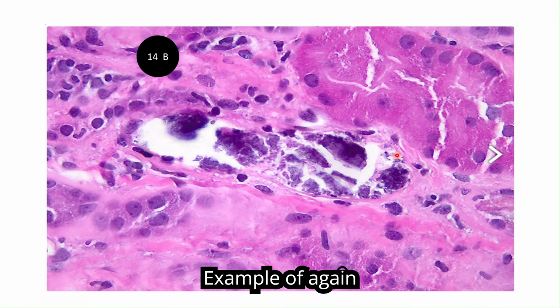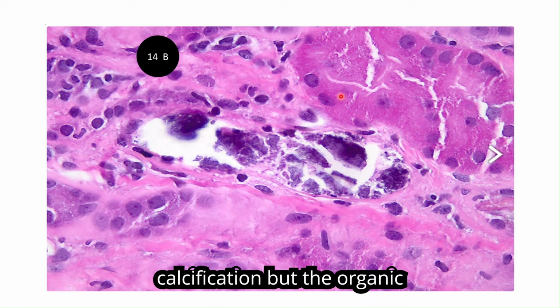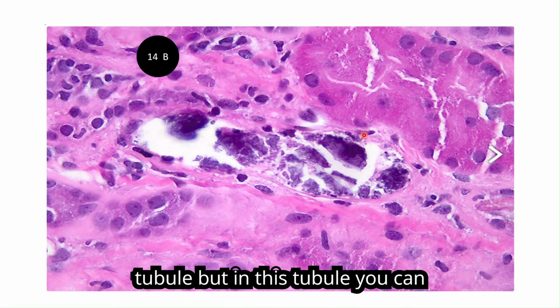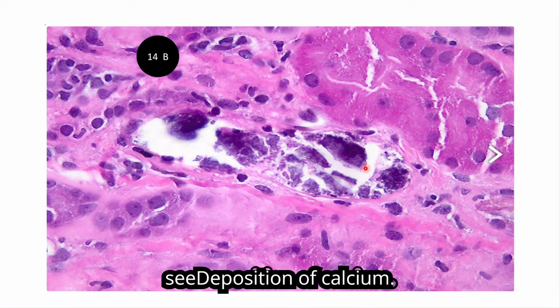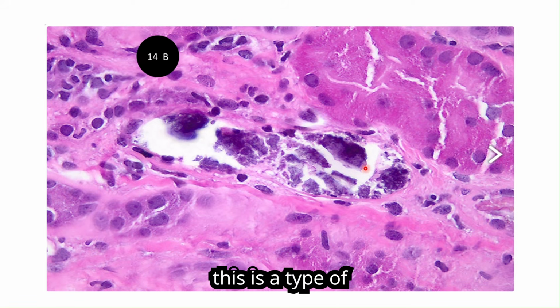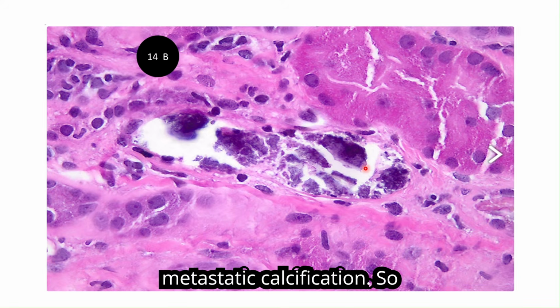Example of again calcification, but the organ is kidney because you can identify here tubule. But in this tubule, you can see deposition of calcium. So this is the nephrocalcinosis, and this is a type of metastatic calcification.